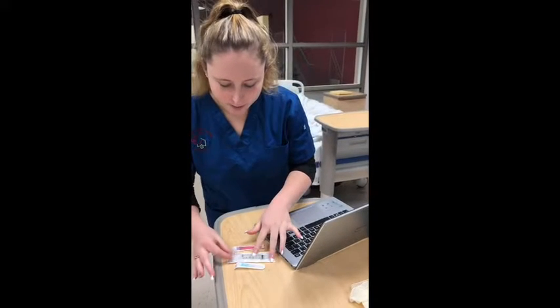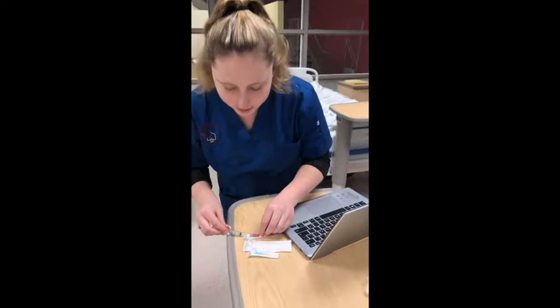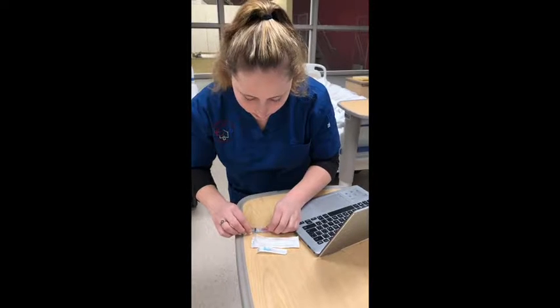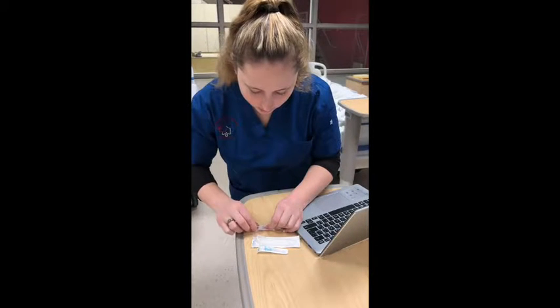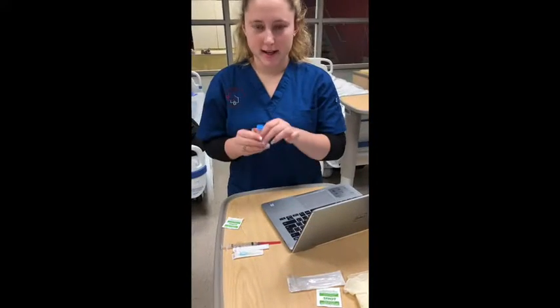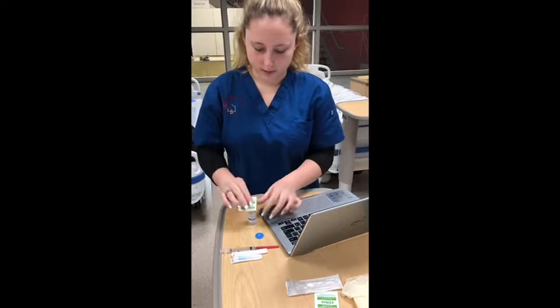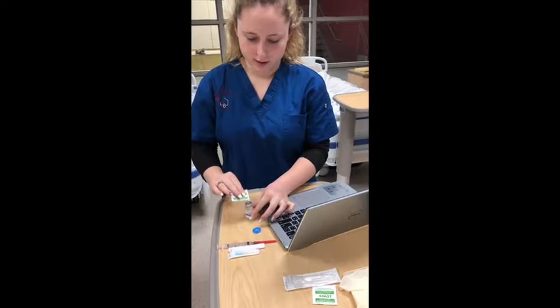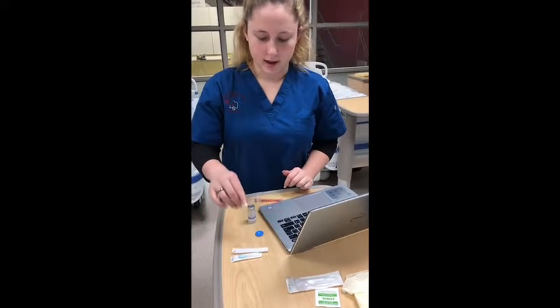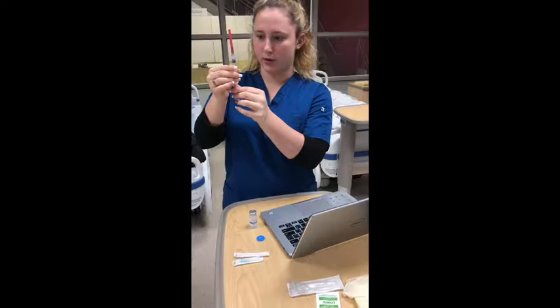So I'm going to start with grabbing my syringe, and then I'm going to attach it to the blunt fill needle. And take it out. So I'll begin by taking the top off the vial and cleaning it with my alcohol wipe. And I would dispose of that. And then I'm going to pick up my syringe, and I'm going to take 1 milliliter of air into the syringe.